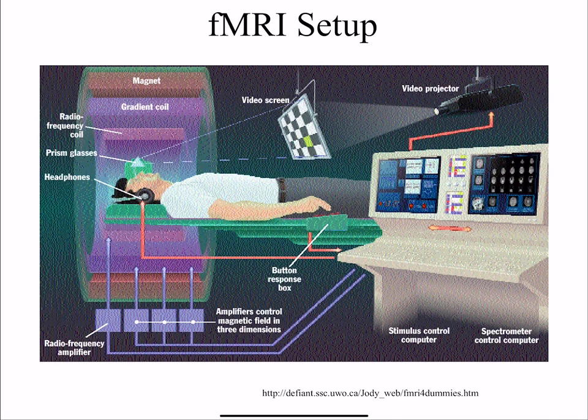So an fMRI setup is basically you put the person in the magnet, and the only real difference is you might have them doing something. So you might have them play poker, do a gambling task, do virtual reality, play video games, whatever you can think of humans doing, someone has probably done it in the magnet. And I mean virtually everything. Even dogs, they're doing fMRI of dogs now to understand why dogs and people get along so well. We even tried to image a shark once.